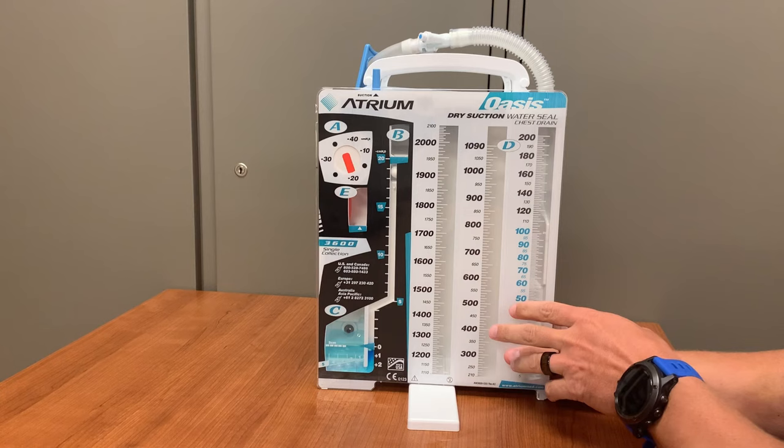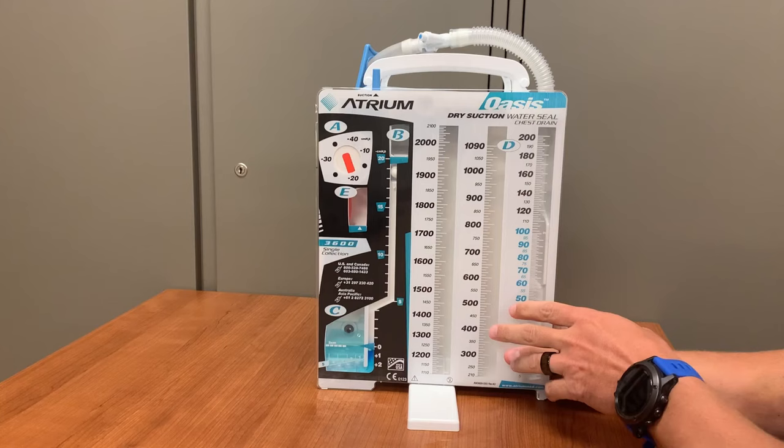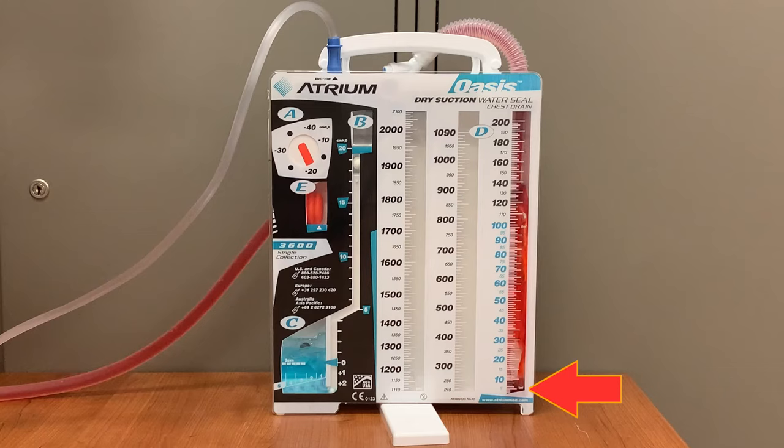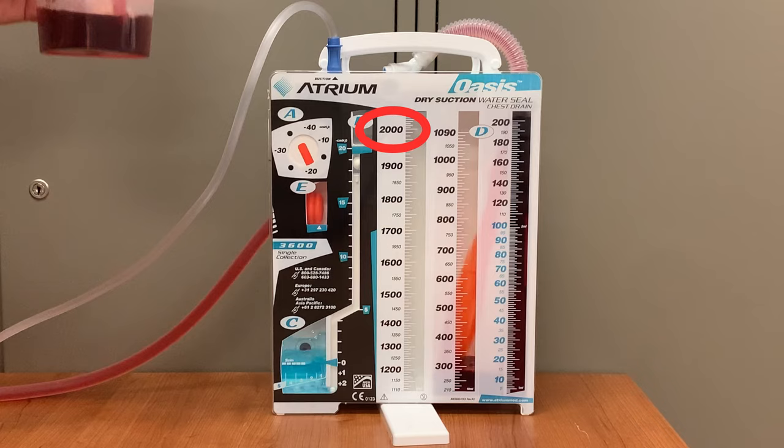The chamber at the bottom of the unit, labeled C, contains most of the water that was inserted into the Oasis. This is the chamber where bubbles will appear if there is an air leak or air is being pulled from the patient. This will be explained more in depth later in the video. The three columns on the right, labeled D, are where suctioned fluids will be stored and measured. Fluid will first fill the far right column to capacity, then the center, and finally the leftmost column to a total of two liters. Measurement markings on the columns allow for easy measurement and documentation of output volumes.